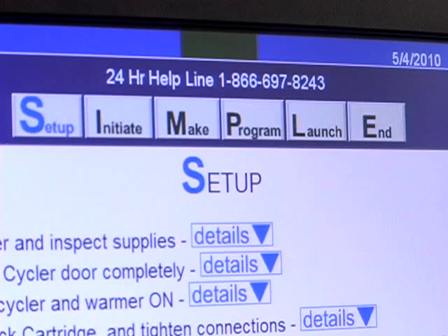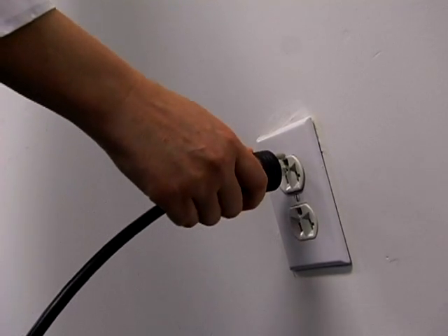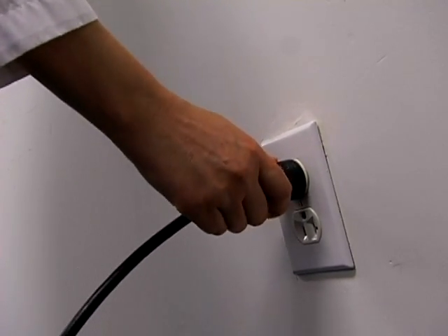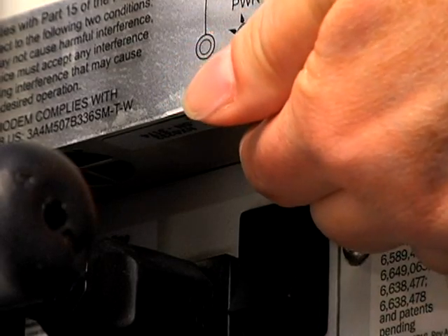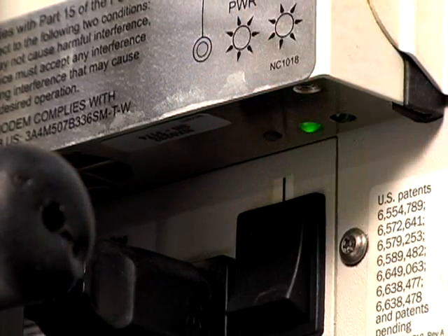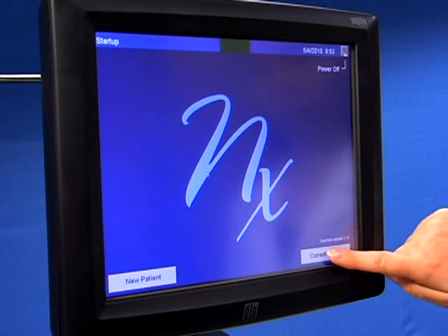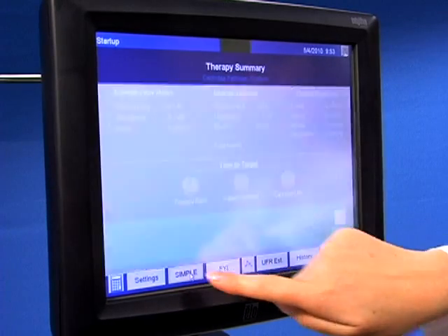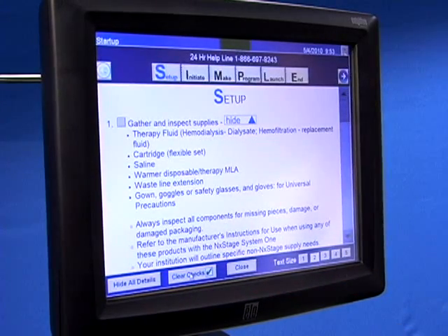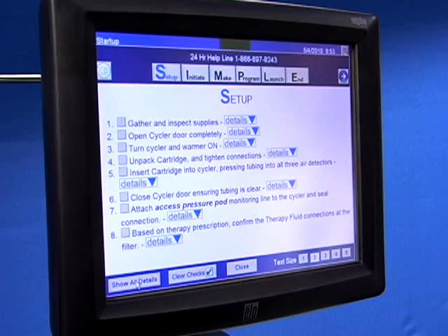Let's start by turning on One View. You can remove the power cord from the wall outlet and reinsert it, or depress the reset button on the jewel box. Wait for the standby screen, then choose new patient or current patient as appropriate. Click on the simple button located on the bottom of the therapy summary screen and follow the instructions. Click on details for more information.